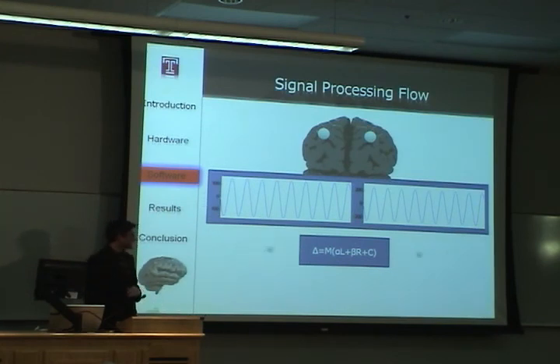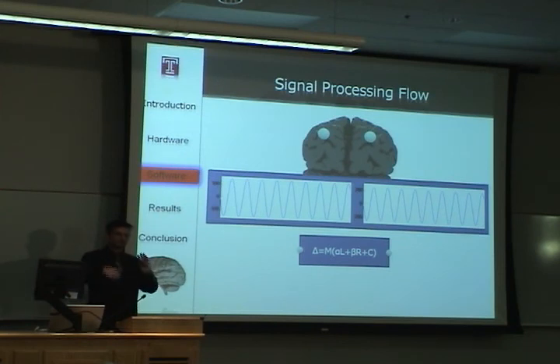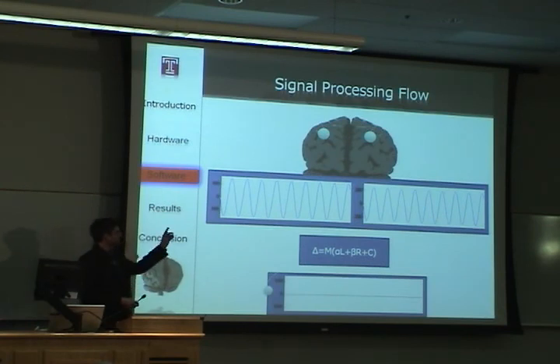So once we get the data, put in frequency data, we eventually end up having the whole entire array of frequency data that goes out. But for this particular thing that we're doing right here, even though the two signals are coming out at two different amplitudes, we know that our two weighted values, two multipliers, are going to help correct for the two differences in the signals and make them equal, and then flip them. And by doing so, we're able to get a whole entire array of values, which in this case, two signals cancel each other out, giving us no cursor movement.